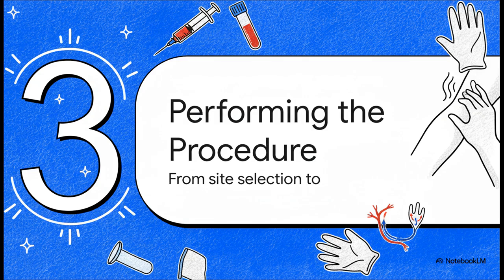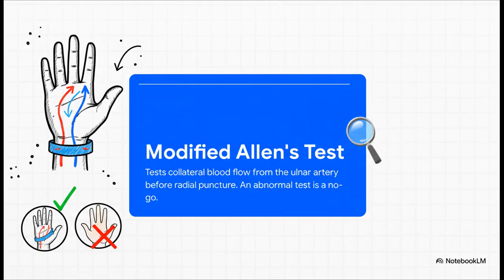All right, we've decided it's necessary and safe. Let's walk through the hands-on part, how to actually get the sample correctly. I just mentioned the modified Allen's test, and it is so important it gets its own slide.